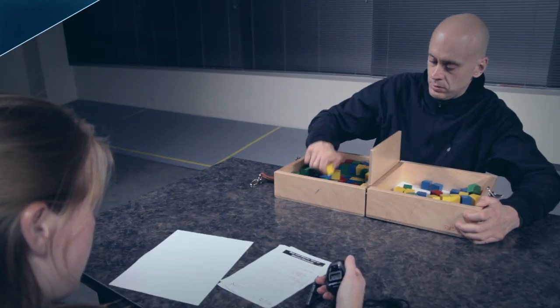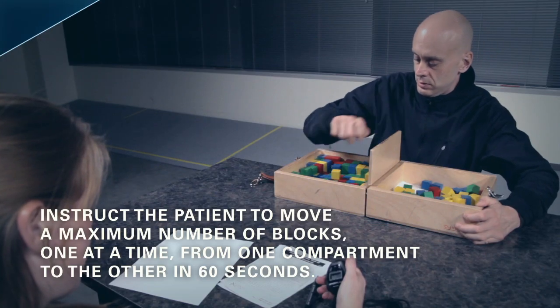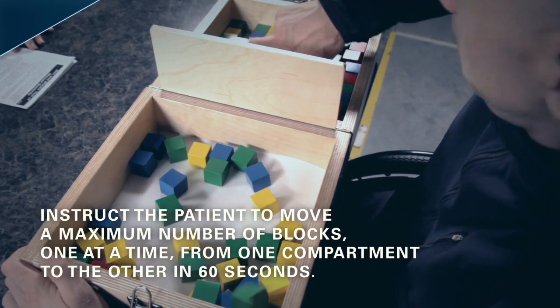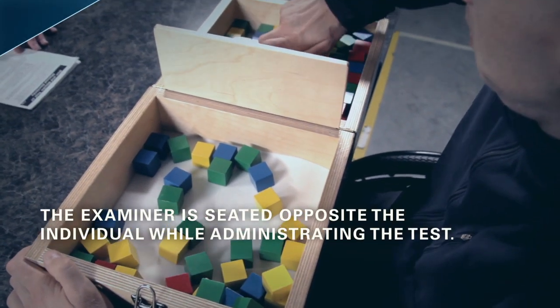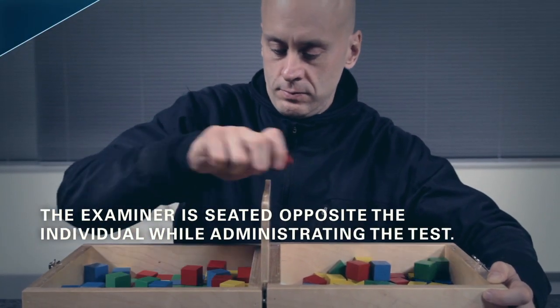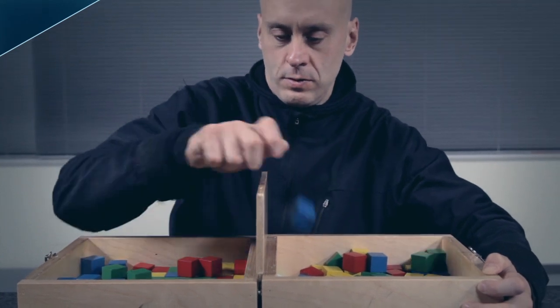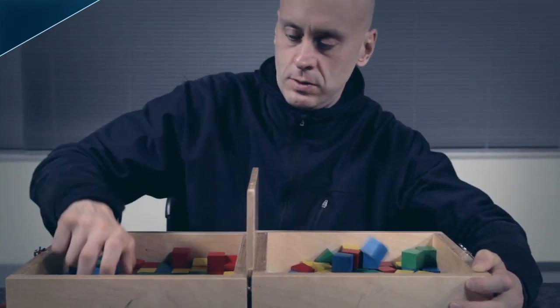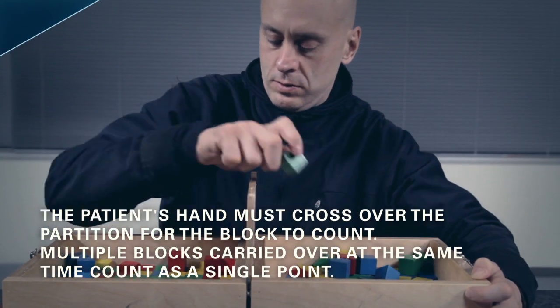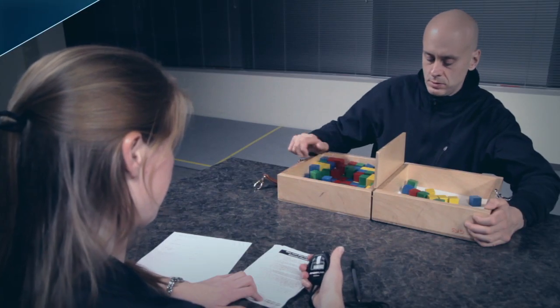Procedure. The individual is instructed to move as many blocks as possible, one at a time, from one compartment to the other for a period of 60 seconds. The examiner is seated opposite the individual in order to observe test performance. The patient's hand must cross over the partition in order for a point to be given, and blocks that drop or bounce out of the second compartment onto the floor are still rewarded with a point.